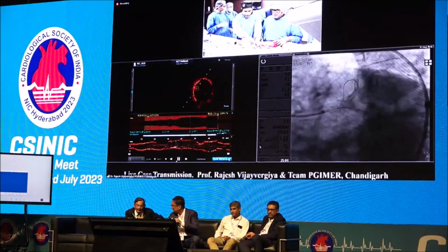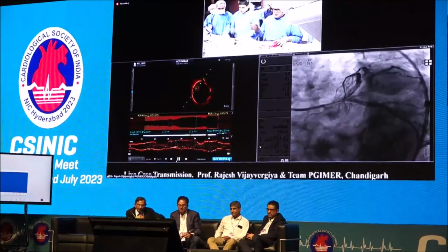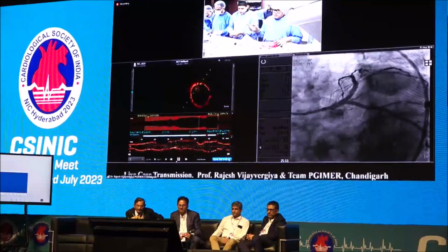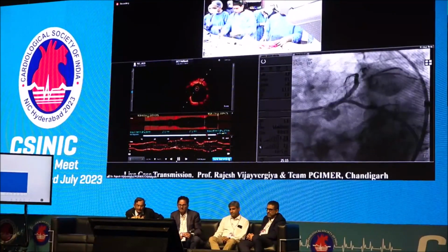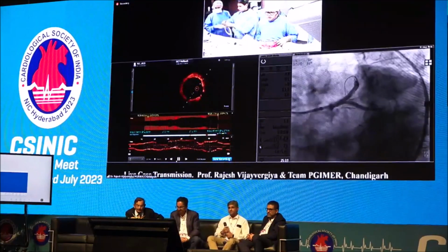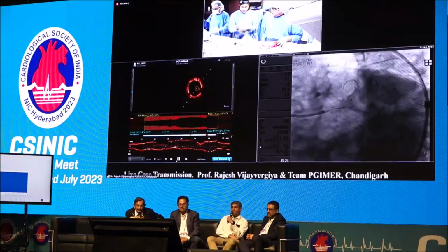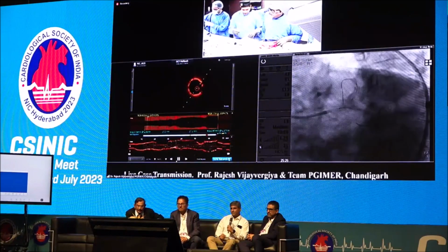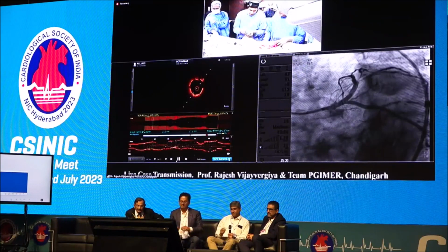Do you agree, sir? Yes, actually there is some narrowing near the angle. What we are going to do is 3.5 NC across the LCX, and the 4 millimeter is already there in the LAD. So kissing balloon dilatation at 18 followed by 12 atmosphere, to be followed by a POT with say 4.5 or 5 millimeter depending on the dimension of the left main, and then the final OCT across both LAD and LCX.